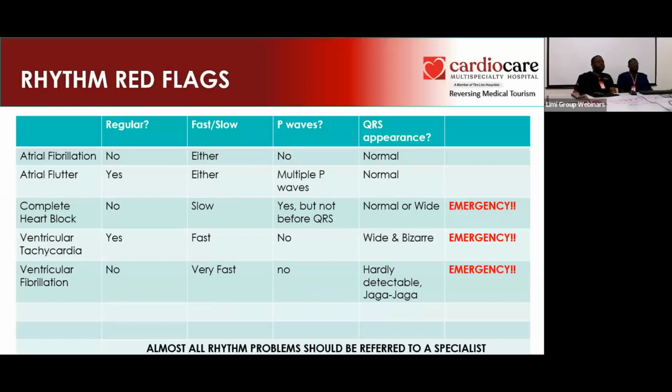In complete heart block, it is irregular. There is a very simple sheet of common ECG patterns you should know that we have shared with you as well. It is all in your chat box, common ECG patterns that you should know. It's on our website and it's there for free. Share it, tag us, and refer patients to us, and to any cardiologist that's available. All right, so just look at this and you will know. So that is essentially how it is.